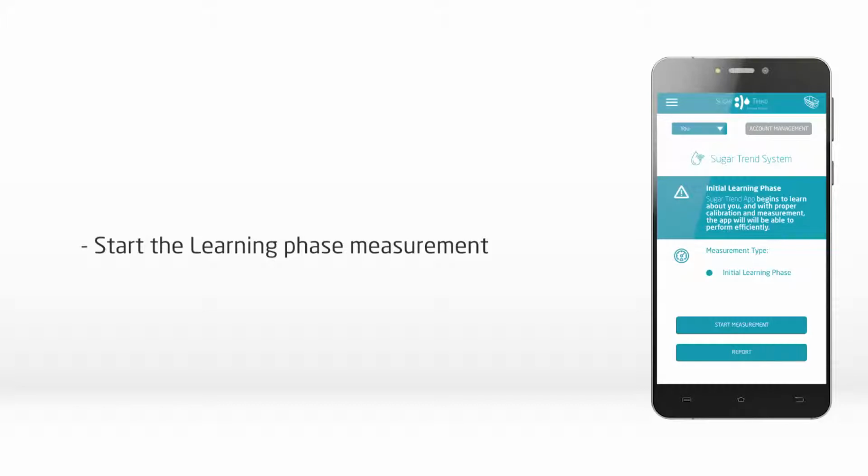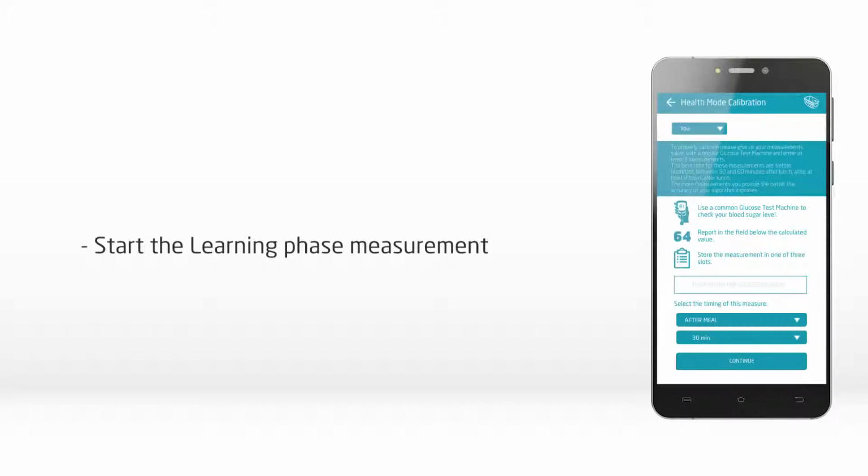Start the learning phase measurement. Choose Initial Learning Phase in the app dashboard.